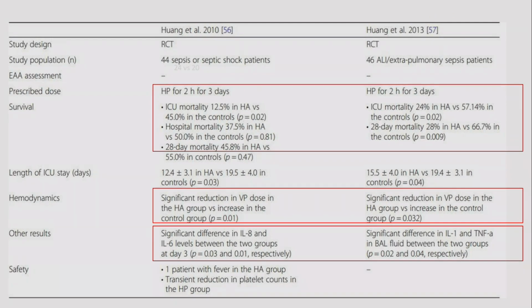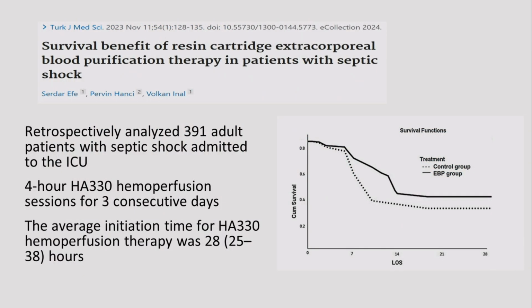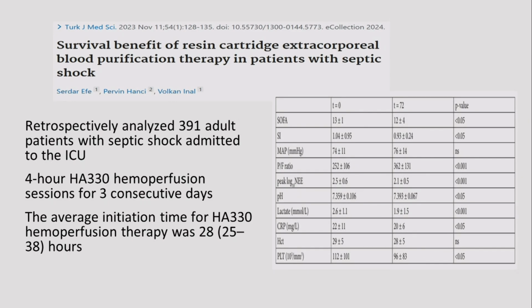And there are multiple trials here, but I would like to show that it is not only the removal of the mediators of sepsis, but there is mortality benefit also. And when it is compared with CytoSorb, yes, definitely CytoSorb removed it much better, but it is a bench top model. When we compare head-on with CytoSorb and other newly coming hemadsorbers, they work equally well. It was a retrospective study which had HA330 perfusions for 3 consecutive days, and it gave good results.